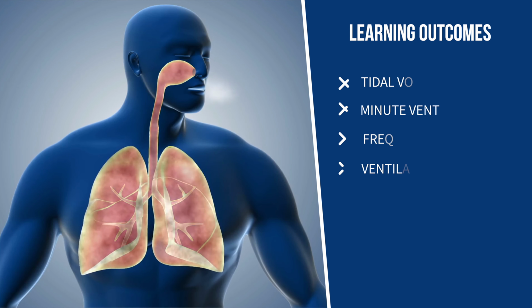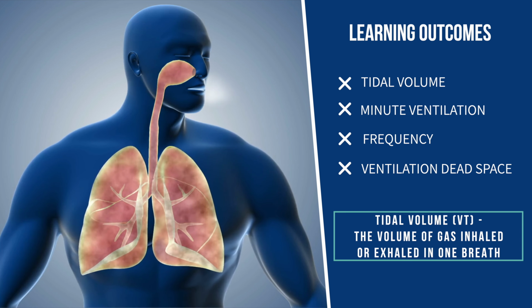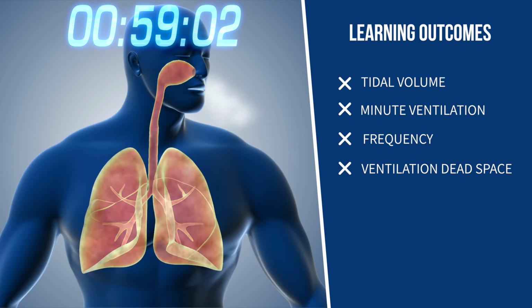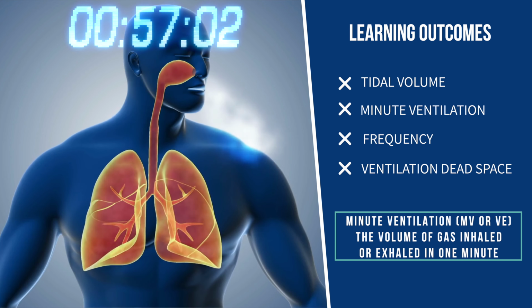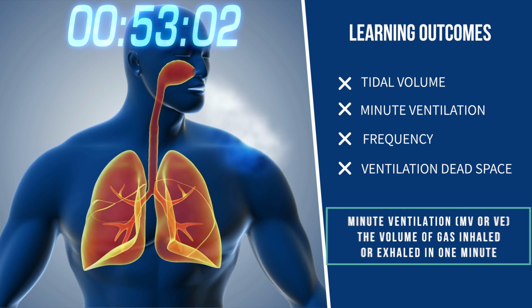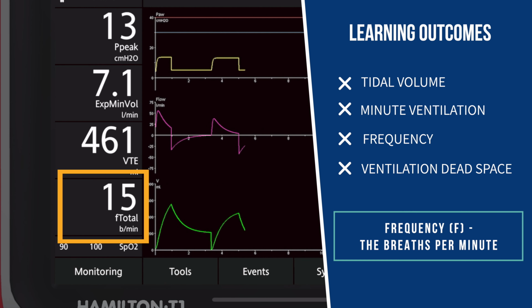This learning module's objectives include lessons related to tidal volume, minute ventilation, also called minute volume, frequency, and ventilation dead space.